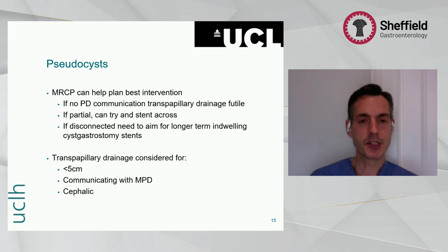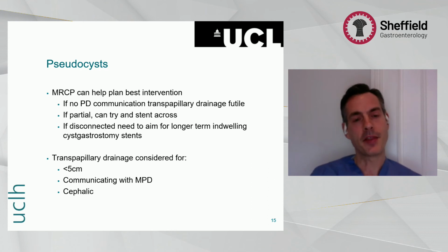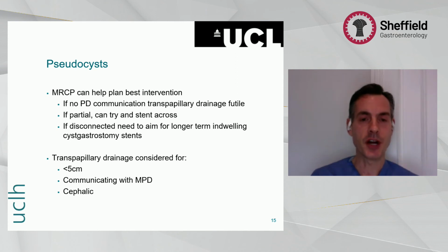A couple of single slides on pseudocysts. I think we're all very versed now at draining these transmurally, and I have to say the vast majority of ours at UCLH are drained transmurally. But if you actually think about how these pseudocysts are formed, understanding the ductal anatomy can really help you drain them appropriately.